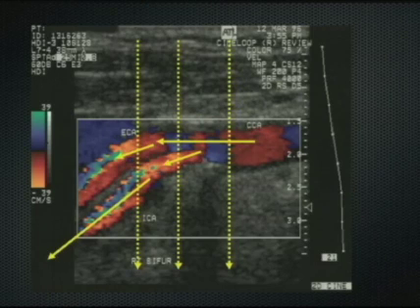Now, the interesting thing about this image is that if we actually carefully measure with angle-corrected spectral Doppler, we find that the velocity at all of these sites is essentially identical. The Doppler frequency shifts, of course, are changing because the Doppler angle is changing, but the velocity is constant throughout the entire image.